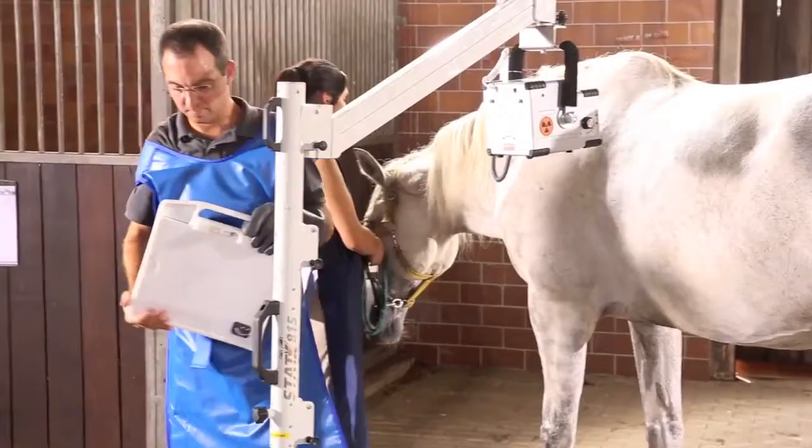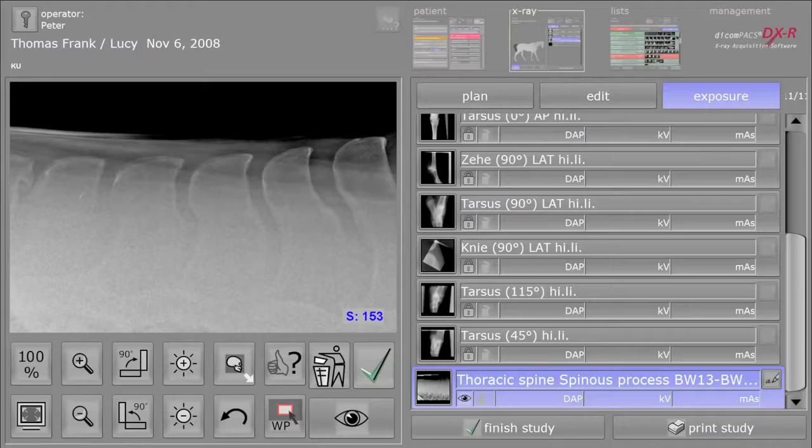Thanks to the excellent detector quality and the enormous dynamic range, even impressive back x-rays can be taken with low x-ray output.